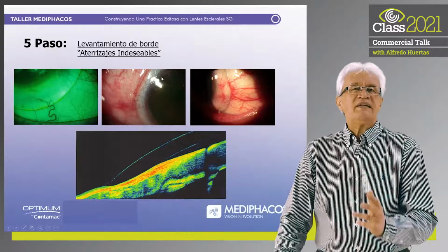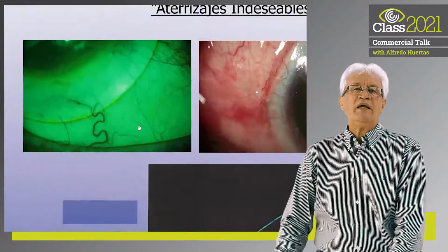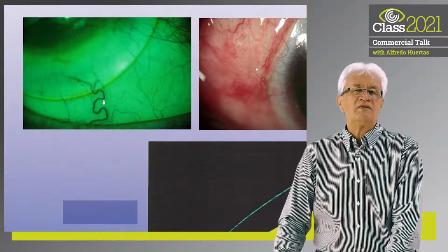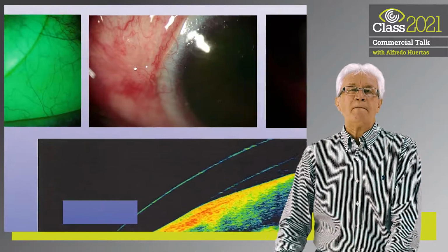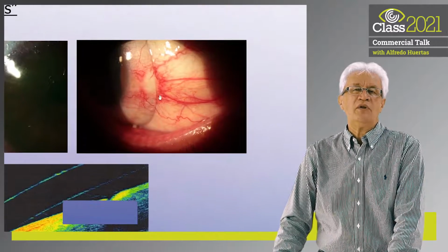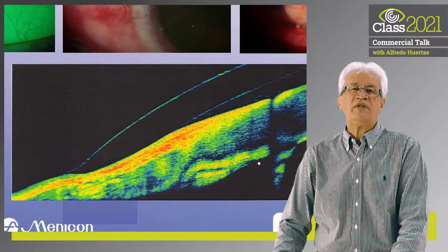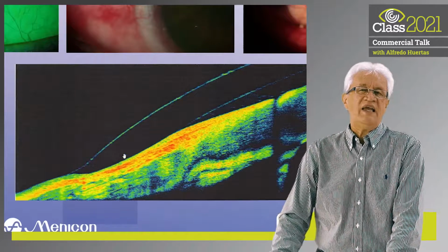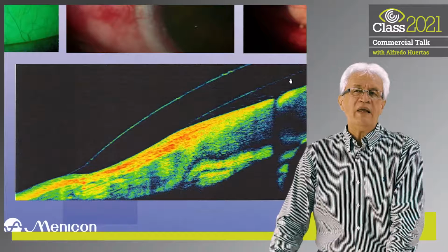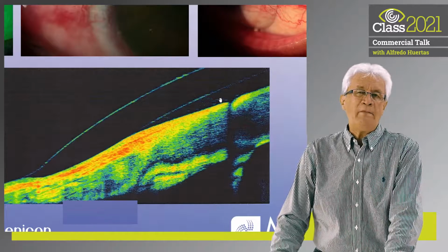What should we see? These are undesirable landings, as you see. Now if we enlarge the images, you will be able to appreciate, in this case, the changes in the sclera. In this, we can see a conjunctival collapse, which is due to the excess adjustment in the scleral border. Here we also have a pterygium that the lens with its edge produces a redness. Now, on many occasions, if we do an OCT, we can see how the lens is buried in the sclera. We can also appreciate the design of the lens, and in this case, it is not the most suitable to land on the sclera.